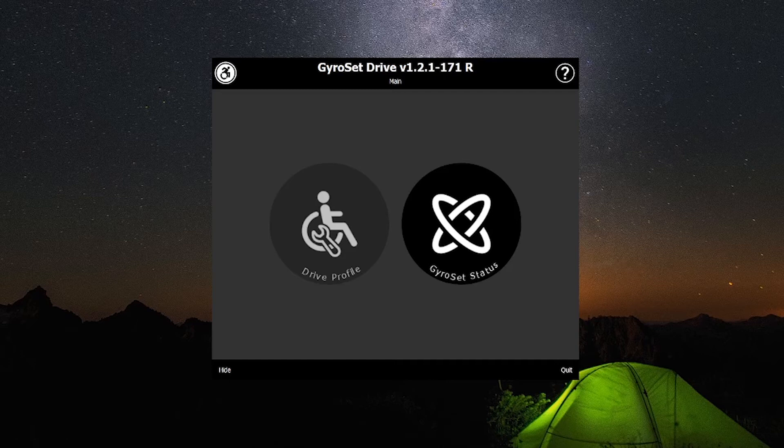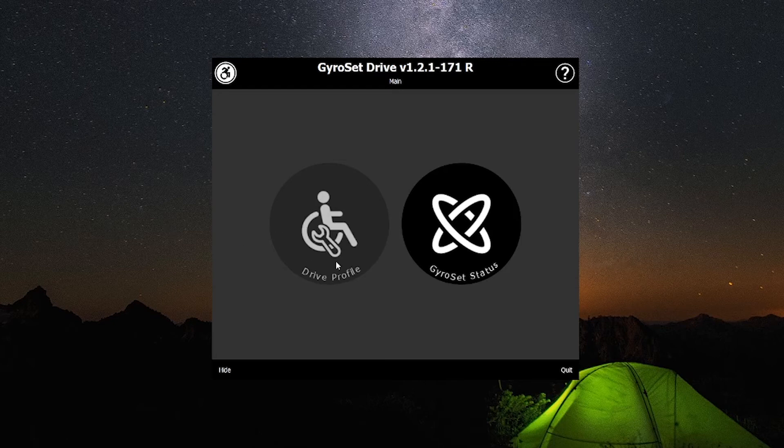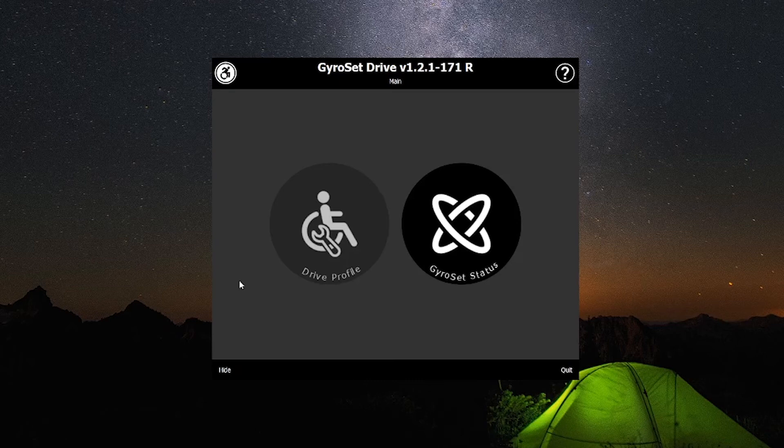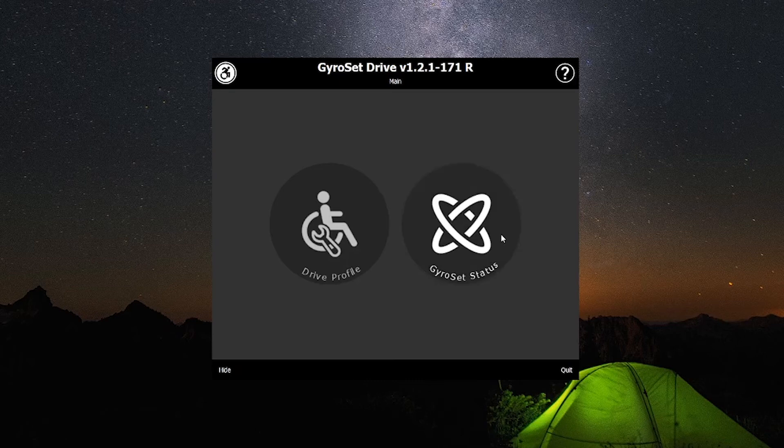Note if the drive profile icon is ghosted and you cannot select it then remove the USB dongle and reinsert it. If the icon is still ghosted after doing this then please check that the Cubo and Link are powered up and that the Vigo is connected by Bluetooth to the Cubo.